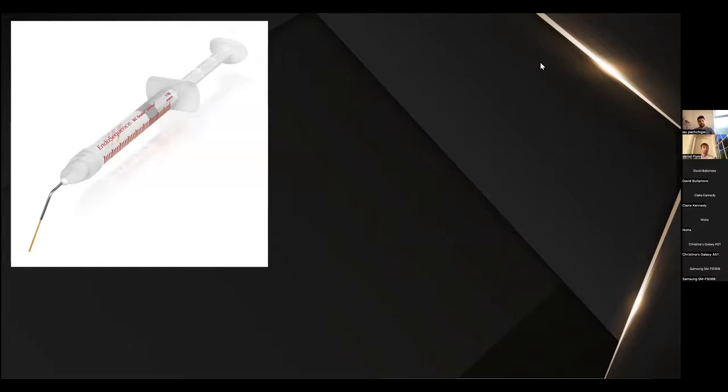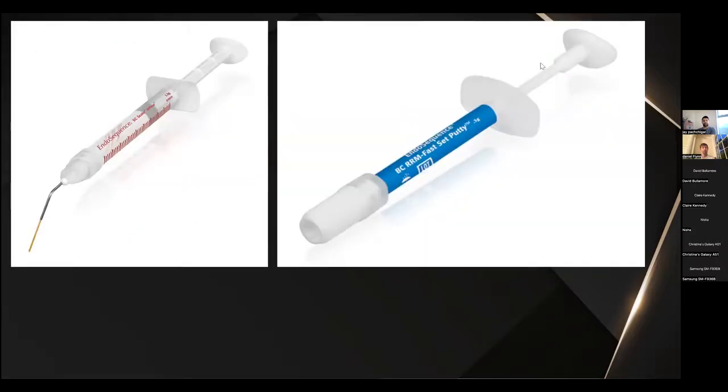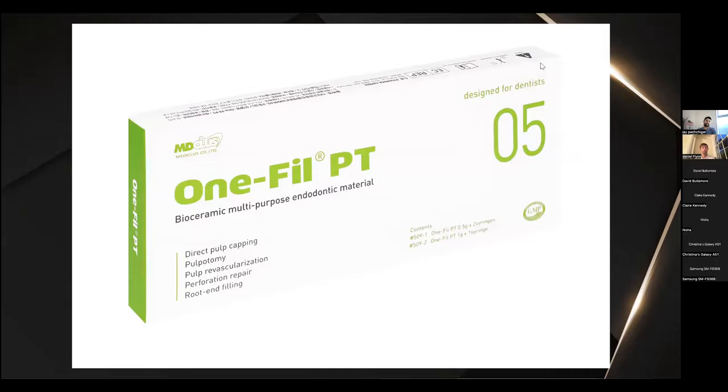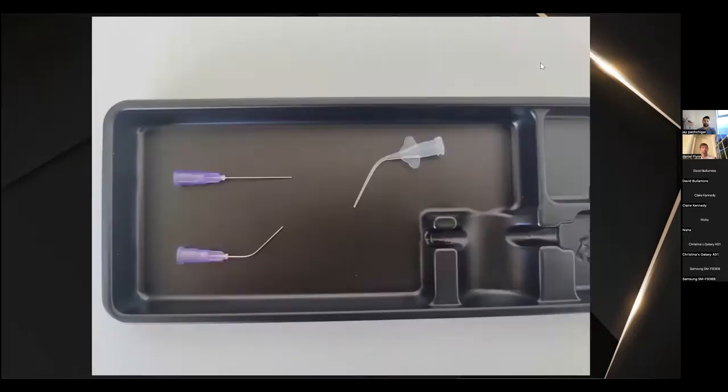They then developed this Endosequence high flow. So these did come with these minimal waste tips, but they had to be bought separately. And then an Endosequence BC Putty. So the ones that I've been using now for maybe over a year or a year and a half now is the One-Fil Bioceramic Sealer. This is most comparable to the Endosequence high flow, I'd say, and also the Bioceramic Putty as well.